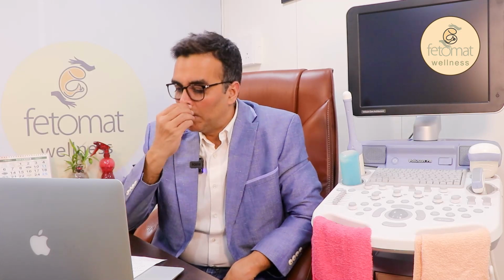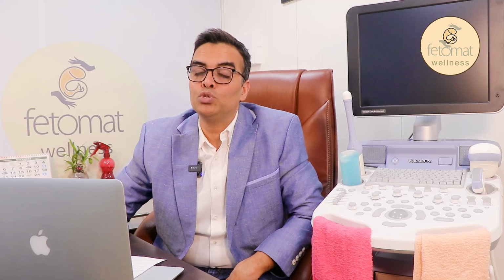So this was all about the diagnostic nature of ultrasound for the infertility assessment, but there is a therapeutic role as well. And this therapeutic role may be in the form of ovum pickup. When we do an IVF cycle, we give hormonal injections, and as the follicles grow and mature, which is followed by serial follicle monitoring, they then need to be retrieved.